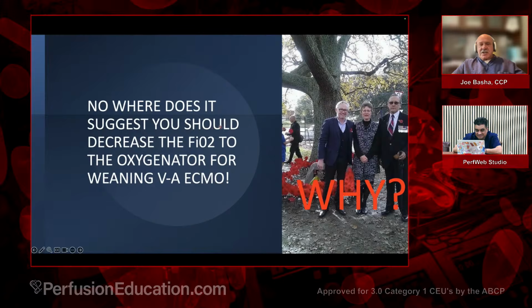Nowhere does it suggest you should decrease the FiO2 to the oxygenator for weaning VA ECMO. I have seen this now several times. It's disturbing. It makes absolutely no sense whatsoever.